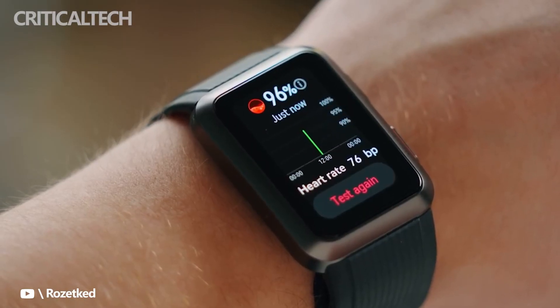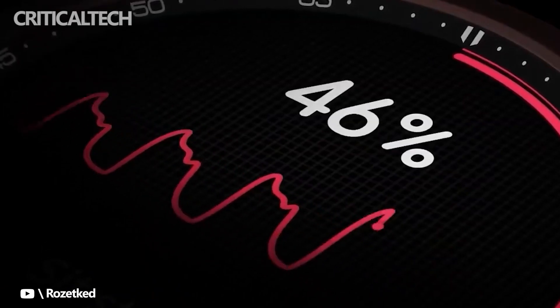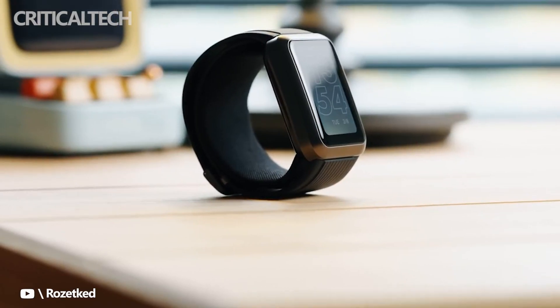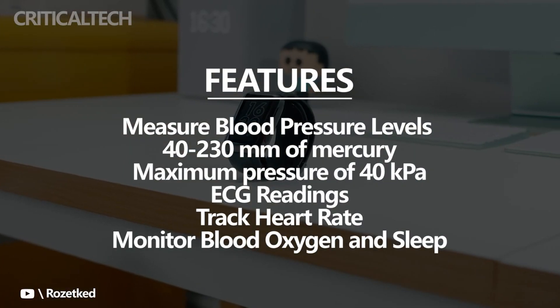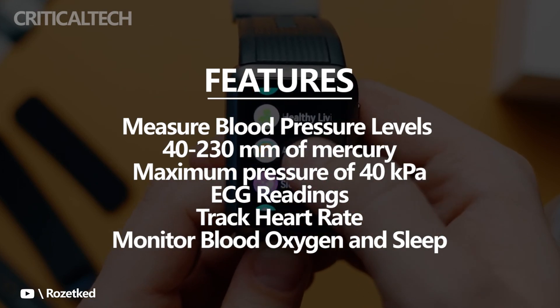The Huawei Watch D has a dual-layer airbag system that inflates around your wrist to measure blood pressure levels between 40 to 230 millimeters of mercury. The mini-pump pushing the air into the bags has a maximum pressure of 40 kilopascal.